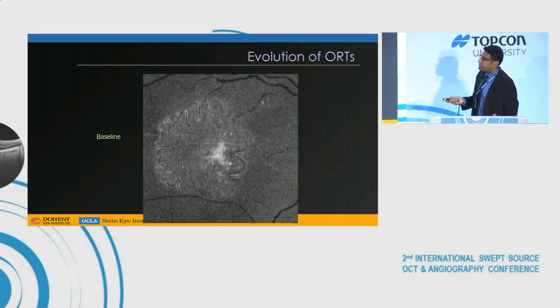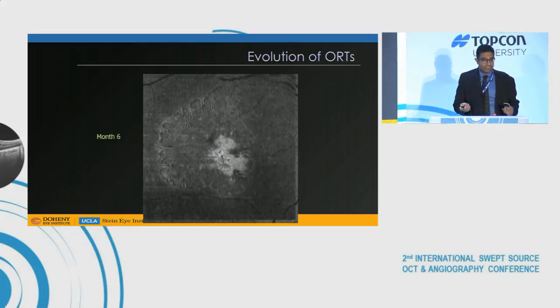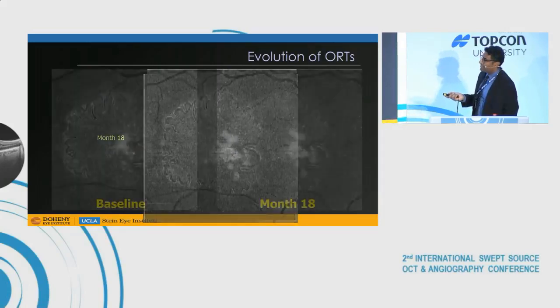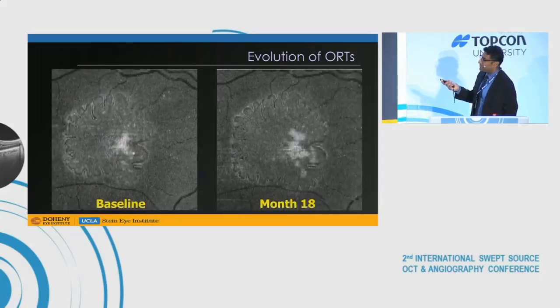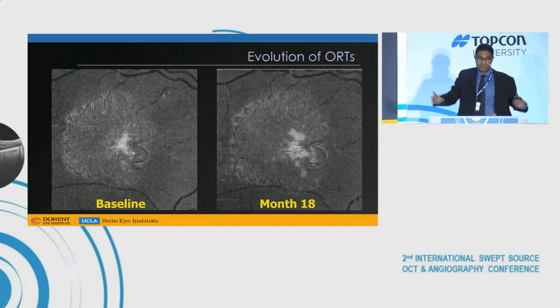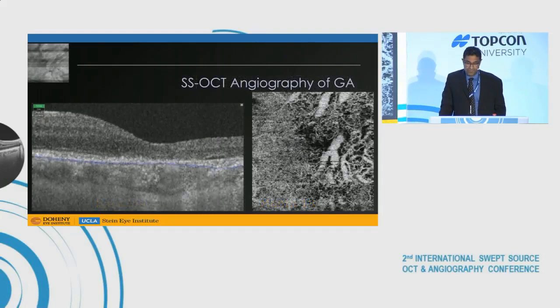And we've been very interested in tracking the evolution of these using swept-source OCT. It's interesting as you track these along, they always connect back to the edge, but there is a dieback over time. I've always viewed these as conduits that are trying to keep the photoreceptors at the very edge alive, but obviously you can only do that so long. Once the conduit gets long enough, I think you're over the cliff.